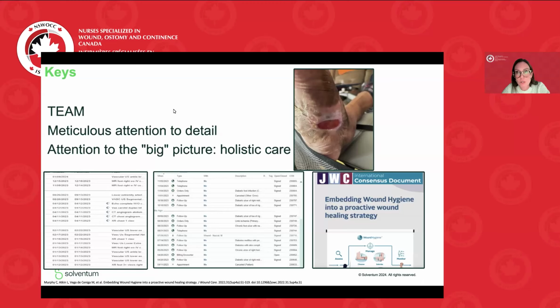Again, this is a patient who didn't want amputation. So that transition from the instill to the traditional negative pressure, the VAC holidays when we needed to, making sure that we're paying attention to his arterial surveillance and making sure he has glycemic control and getting endocrinology on board, getting infectious disease to weigh in. So really meticulous care. He closed almost exactly 1 year to the date of presentation.